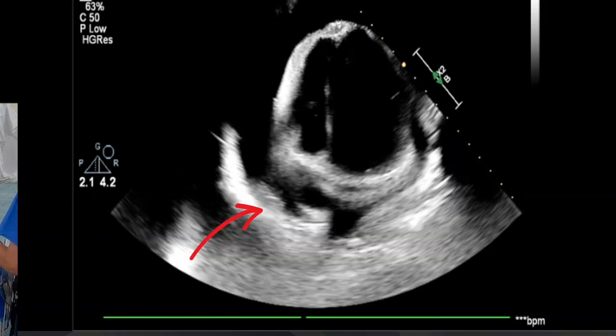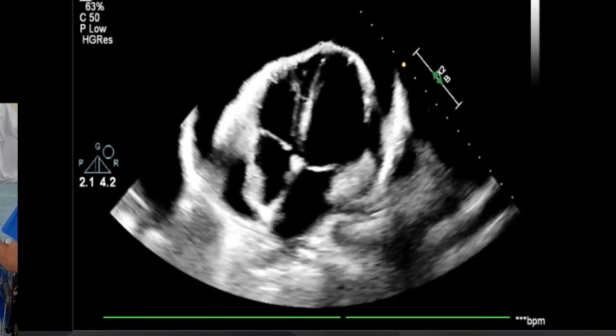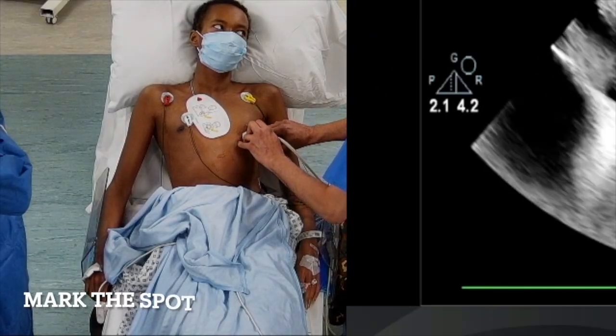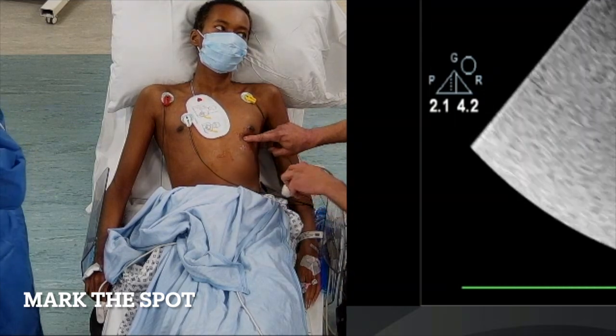To assess whether this patient is in extremis, we look at the right atrial wall — it should be collapsing when relaxed. Diastolic collapse is not happening here, but the blood pressure is a bit low, and so the indication was made to proceed with a drain.